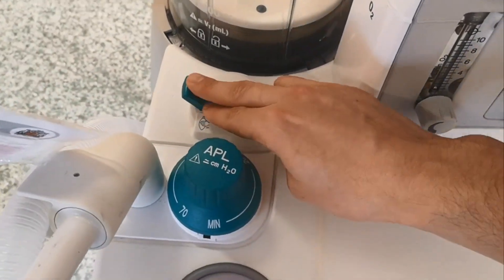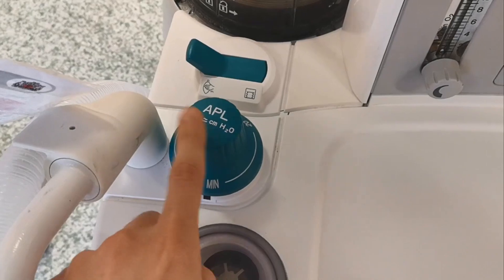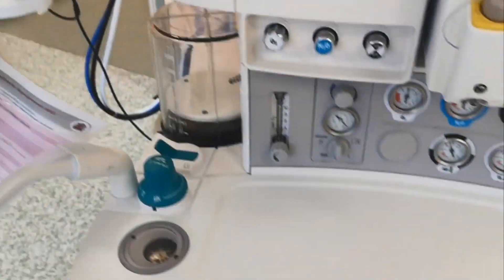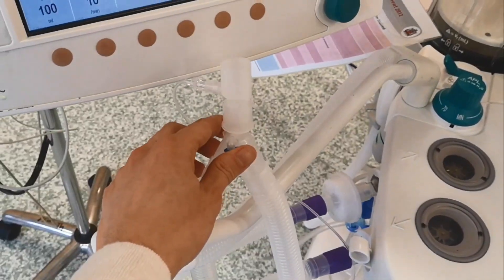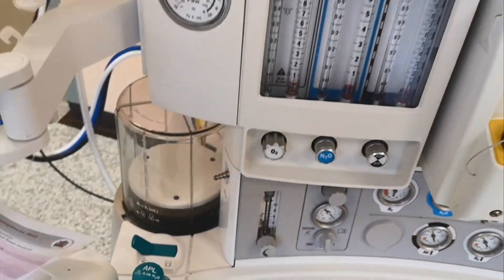There's the usual bag/ventilator switch, and the APL valve. Air and oxygen come from there into the circuit, pumped into the bellow, go to the patient here, back to the machine, back to the circuit, and off you go.